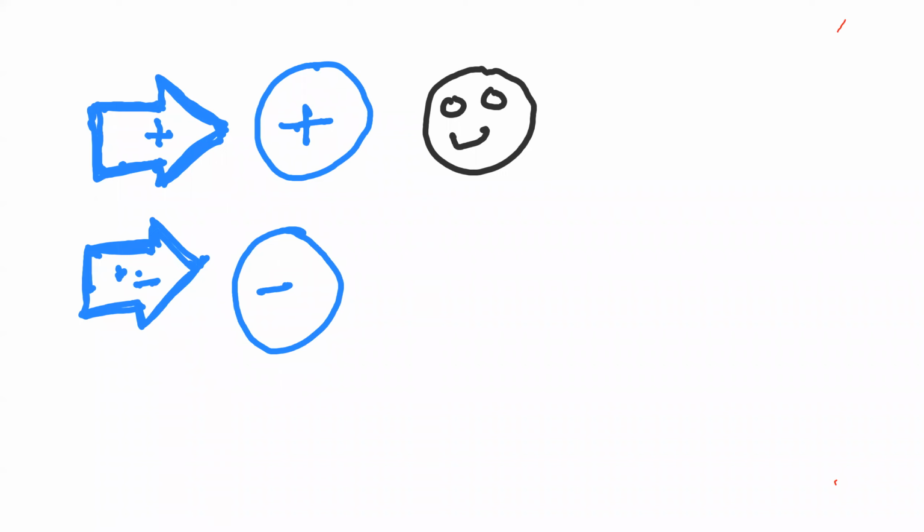Then the needle fluctuation will also be positive. Right? Then, negative electrode again. So, next concept.